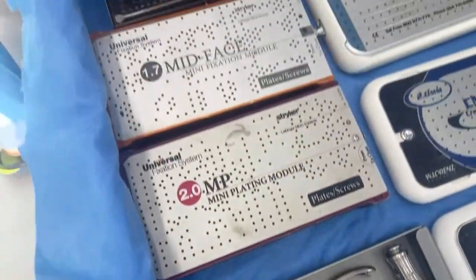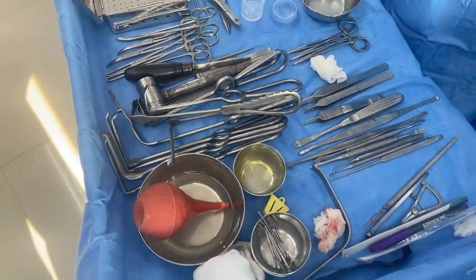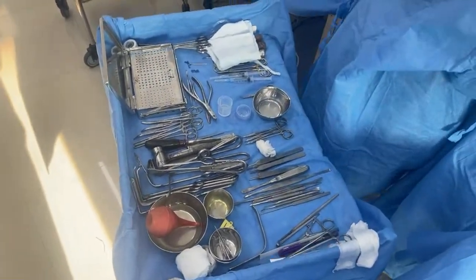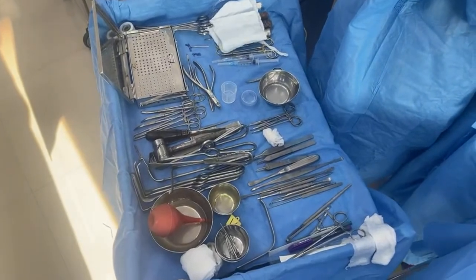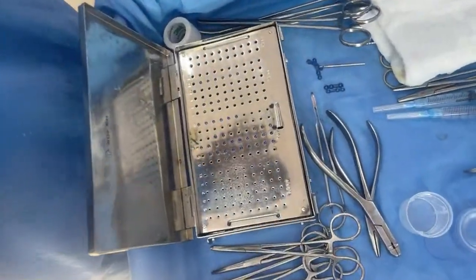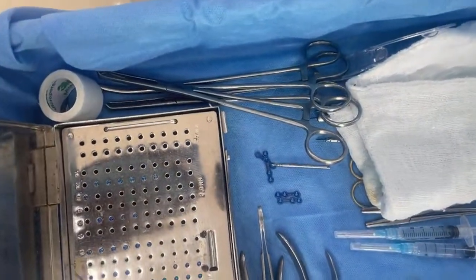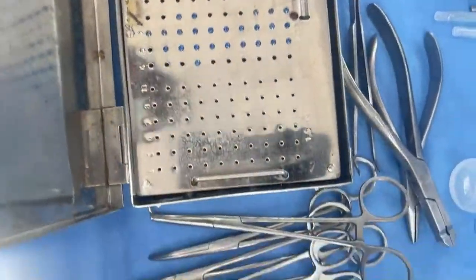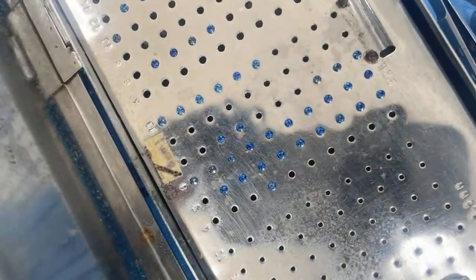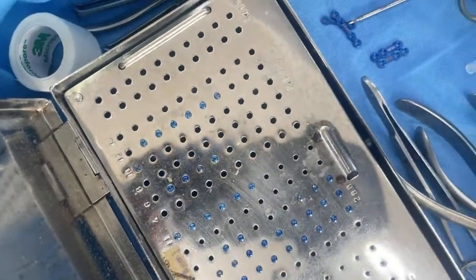Alright, and this one is the basic instrumentation, the armamentarium that we need for any surgery for that matter. A lot of retractors here, some forceps, elevators. And right here are the plates which we will be using. We have both 3-hole and 4-hole plates depending on the bony segment, and also screws. If you notice here, there are numbers on the screws: 6 mm, 8 mm, 10 mm. 8 is what we generally use.